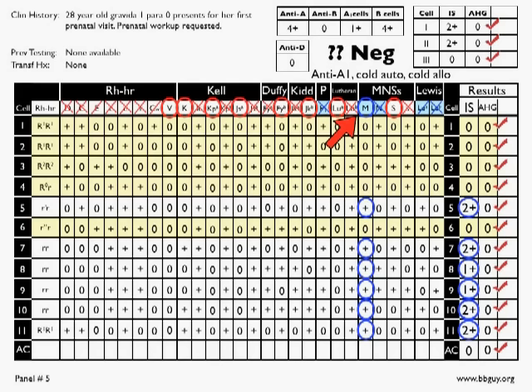In this particular case, it is most likely that the reaction that we're seeing with A1 cells is due to this anti-M, a cold IgM alloantibody, or room temperature IgM alloantibody, that is reacting against the reagent cells that are M positive. So you would get around that by testing some cells using reagent cells that were M negative, for example. So there are several different ways that you can get around that, but most importantly, recognize that it is a recognizable and understandable consequence of having a room temperature IgM alloantibody. Okay, I hope that makes sense.